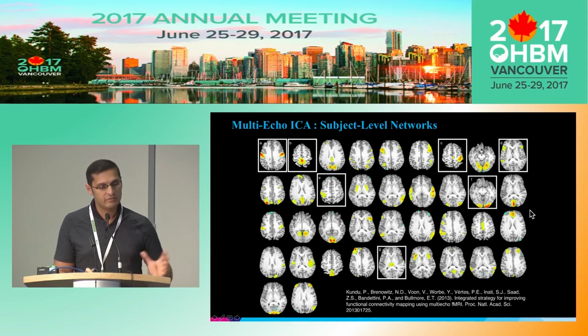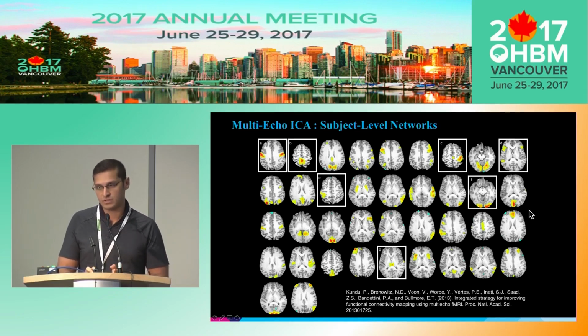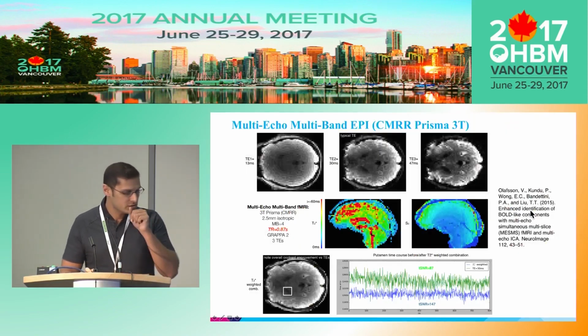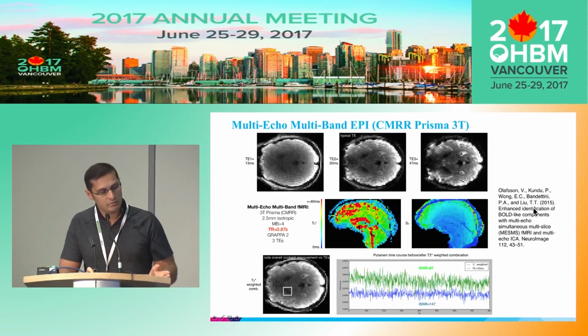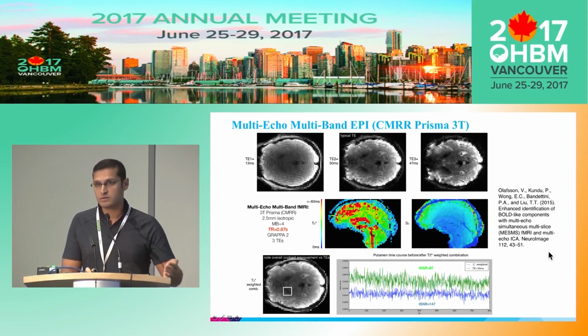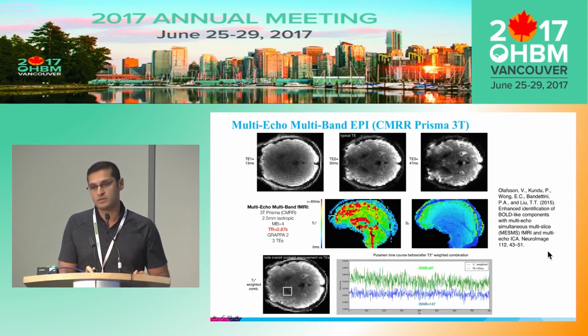But there's a general benefit of higher dimensional representations of functional activity, as well as automatic detection of the functional components. So more recently, we've been able to implement multi-echo, multi-band EPI. Just to give you an example, there are several variants of the sequence. The sequence that's been implemented by the Minnesota group is now a part of the HCP standard sequence, so you could just dial up the number of echoes and you'll have a multi-echo data set.